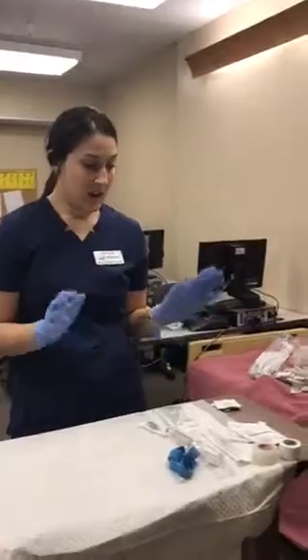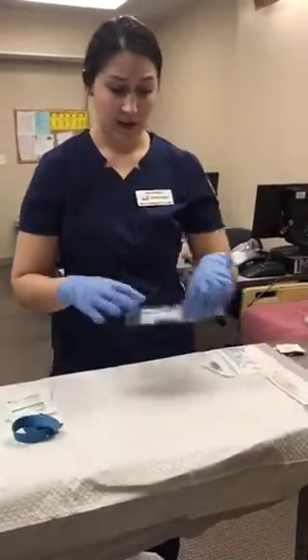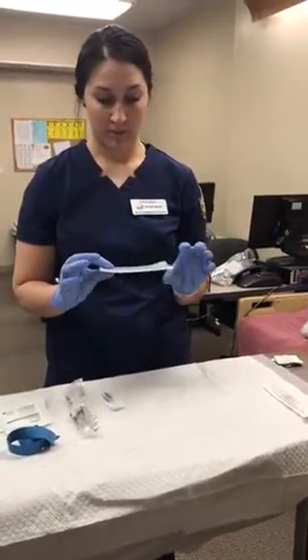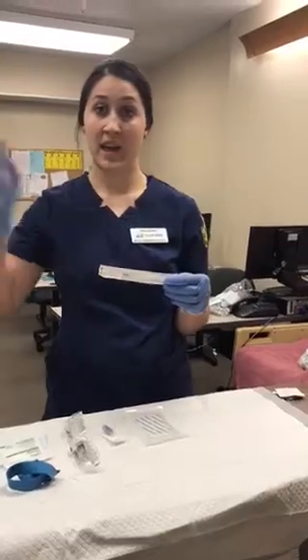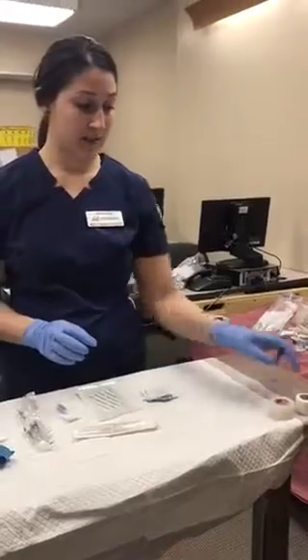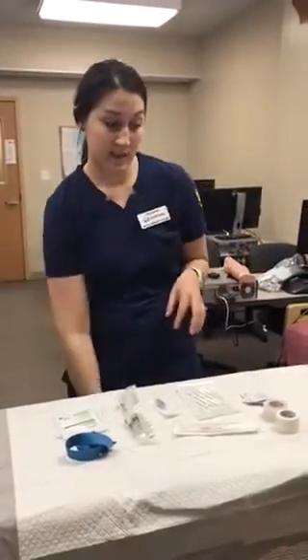So after that is on there, I'm going to prep all the supplies that I need to take into the patient's room. I'm going to take in some gauze pads in case there's any bleeding, my tourniquet, a flush, a saline lock, a transparent Tegaderm for over the IV site, and my 20 gauge needle, which I'm selecting based on what we are infusing, our medication, and the patient's age. So we want to make sure that's the correct thing. I'm taking some alcohol pads, and I am also taking some different types of tape to secure some stuff down. I will then take my gloves off, clean up my station, and make sure that everything is put away and no patient identifiers are left out.